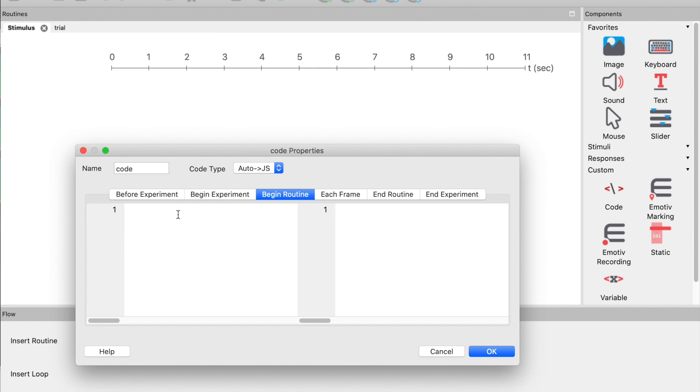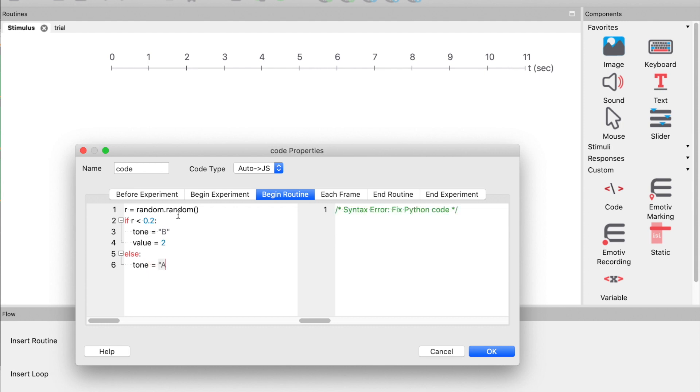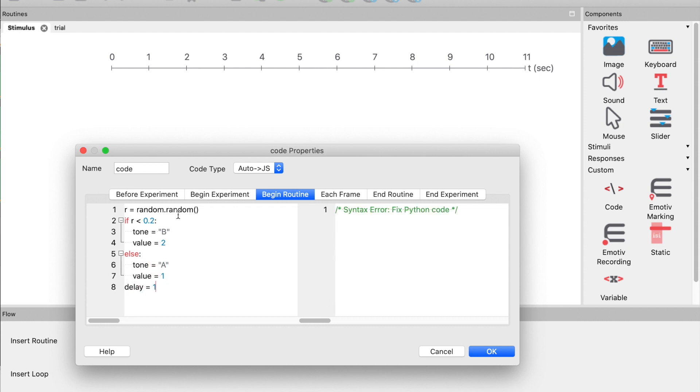In the begin routine tab, let's set the tone to play. We will just play an A or a B. The B will be played only 20% of the time. Let's set the delay to be between 1 and 2 seconds.